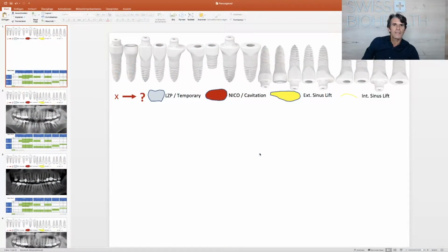Welcome, colleagues, to our first planning webinar. I would like to explain how we do patient planning at the Swiss Biohealth Clinic, how we select the implants, and how we transfer that to a list to always have the right implants in the right amount for the surgery. What you see here is a PowerPoint presentation I prepared for you.